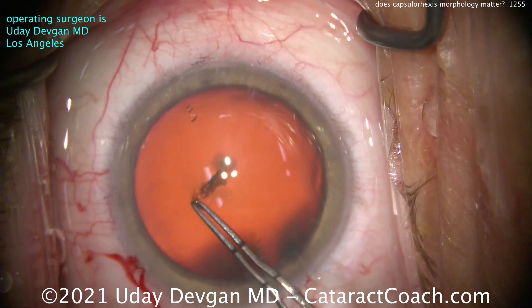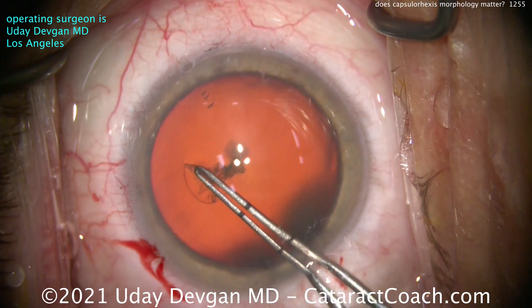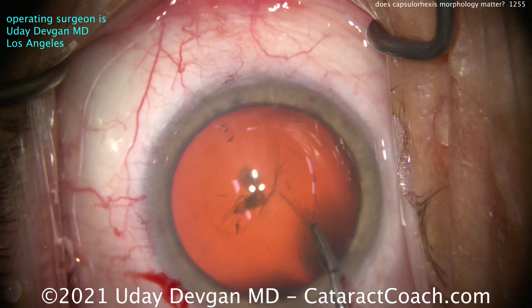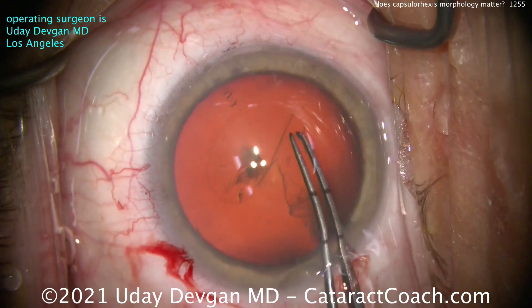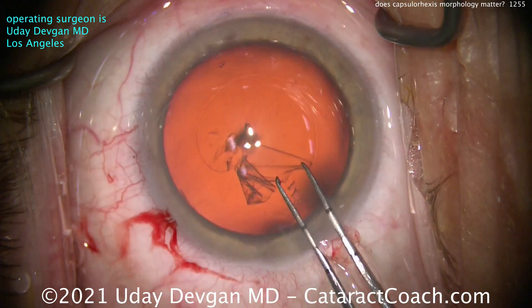Here's where I normally start, and it just doesn't want to go counter-clockwise. Okay, how about clockwise? Alright, we'll take it — it's going clockwise. We'll still do a nice 5mm round capsulorrhexis, and we're continuing it, going all the way around. It looks pretty good so far.